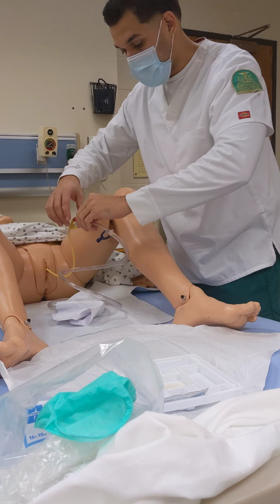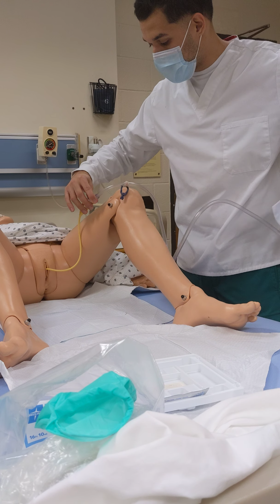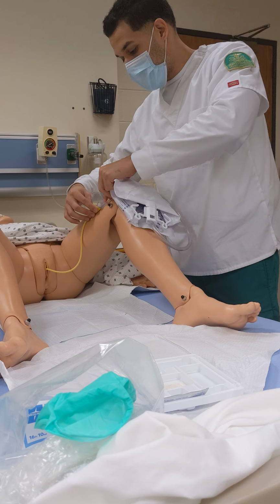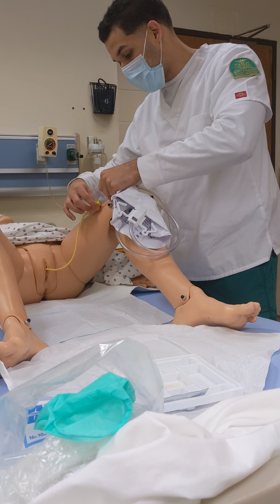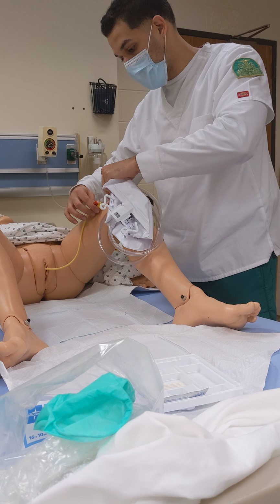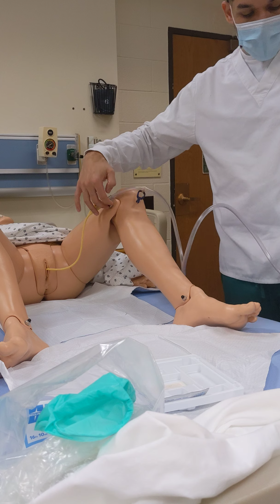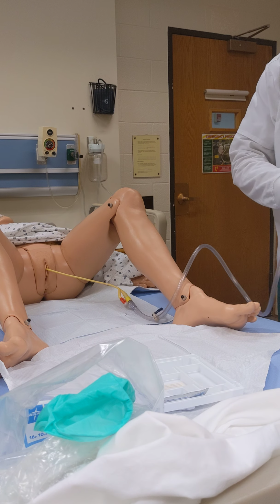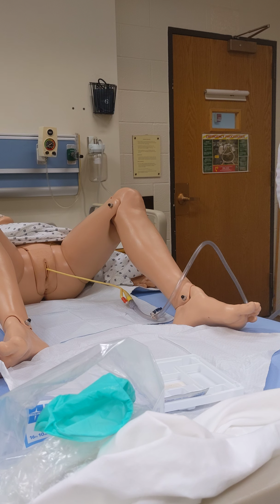And I would tape this to the leg closest to me here, making sure that this tubing isn't pressing into the patient's leg for their comfort and for the purposes of acquiring urine for any reason. That's taped there. I'm going to put the catheter bag on a non-movable location on the side of the bed.